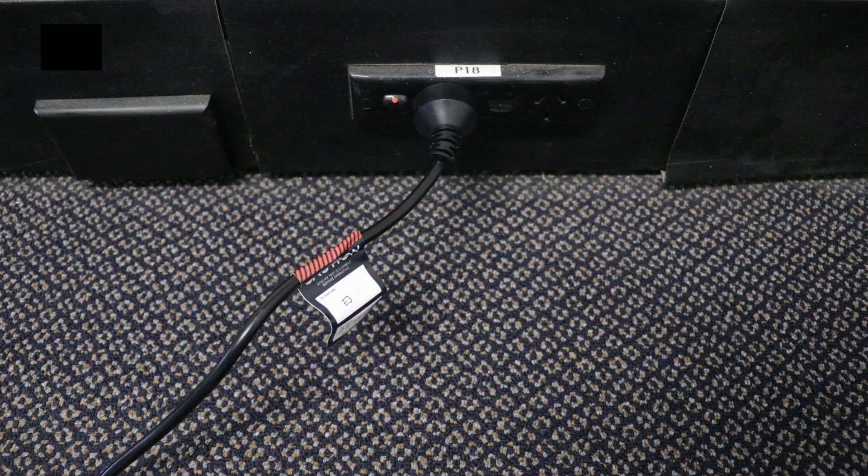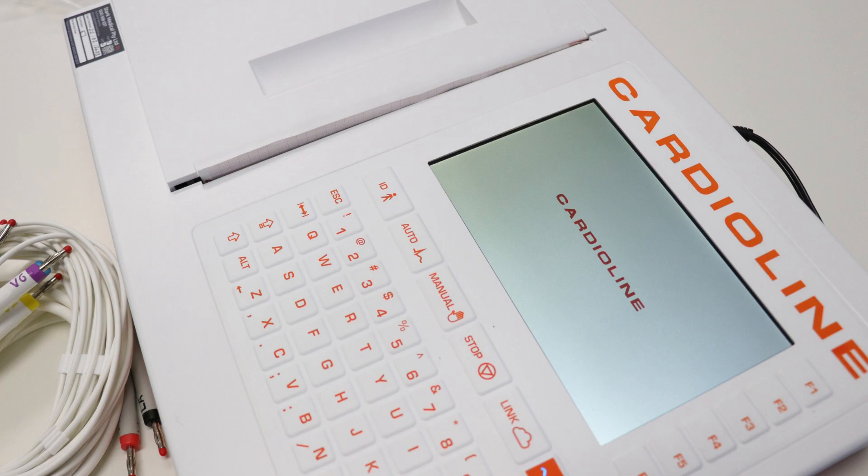Finally, plug the power cable into a power port, turn the power on, and power on the ECG using the orange button. We are ready to go for a test.